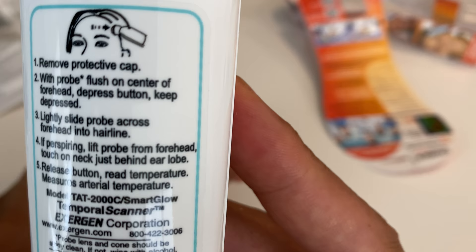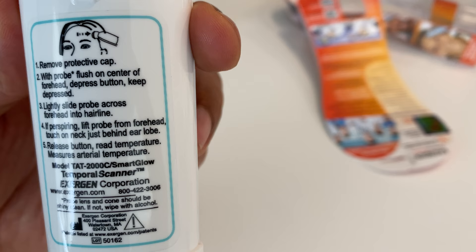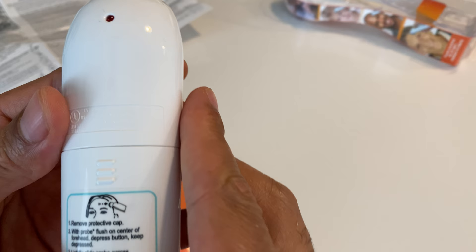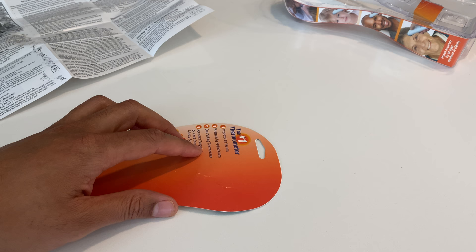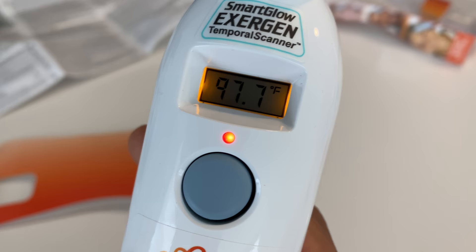Normal human temperature is around 98.6 degrees, so if it gets anywhere near that I'll have a good idea of how to use this. If it's higher I should probably get checked. I'm going to flush it against my forehead, press the button, and slide it across. I press the button, do the scan — and it gives me a temperature reading.